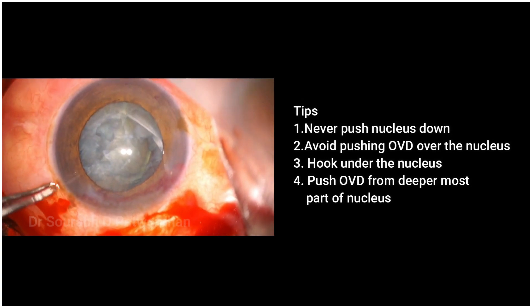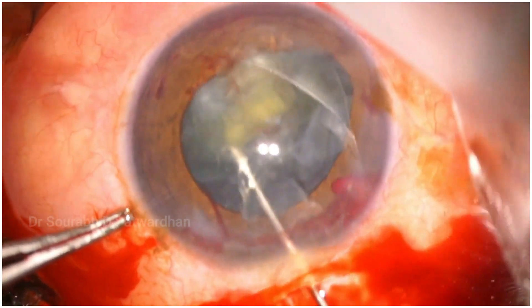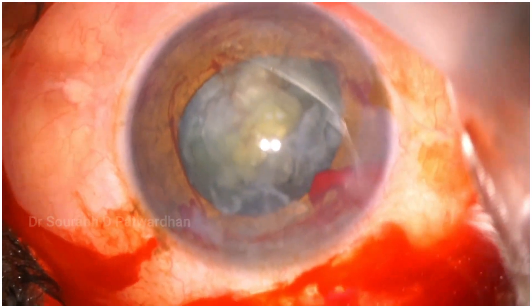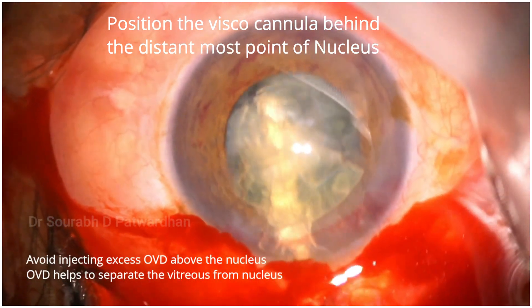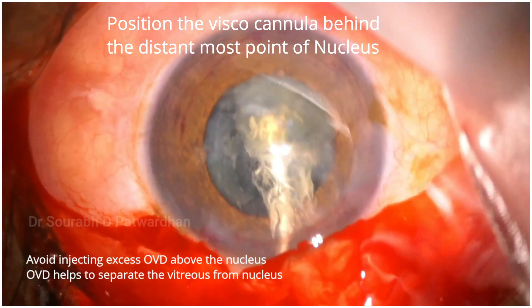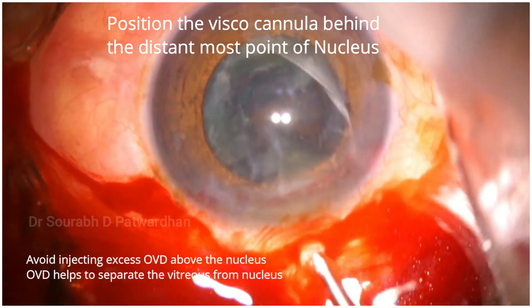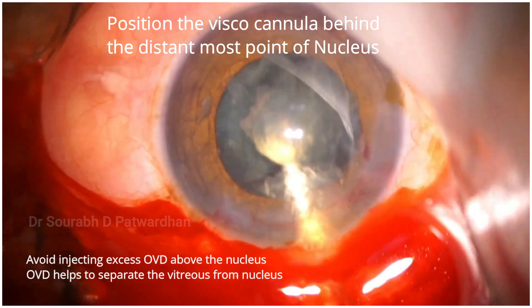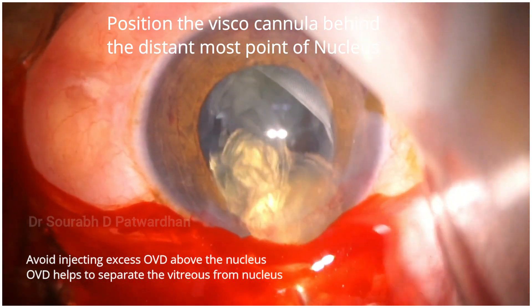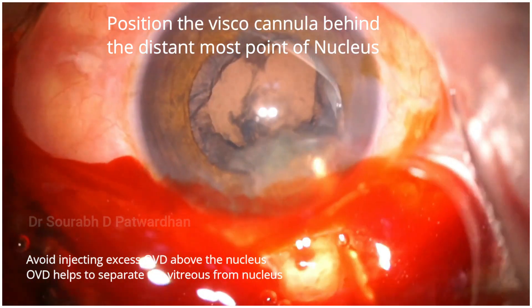Now just watch. Once the nucleus is coming out of the bag, what I am going to do is use a 2% HPMC viscocannula that goes behind the nucleus to the most distant point, and then start pushing the OVD. Don't push OVD over the nucleus pieces, otherwise they may drop down. This dispersive OVD does two things: it brings out the nucleus pieces, and at the same time it separates the vitreous from the nucleus, so there is much less vitreous prolapse when you are taking the nucleus out through the anterior chamber.